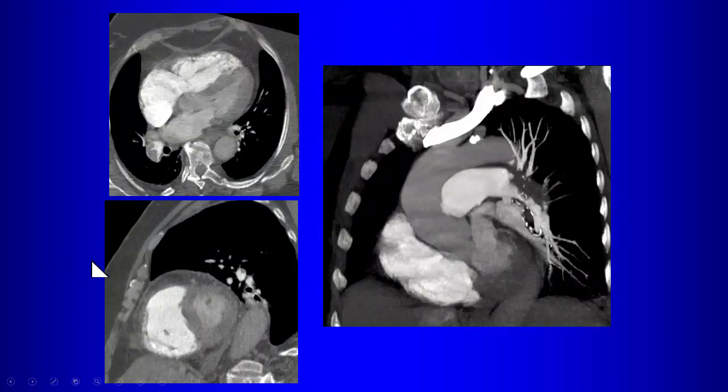Quick question. Since we're talking about PE, the article said that when we have Hounsfield units of 170 to 209 in the pulmonary arteries, that's acceptable. But if it's greater than 210, that's fine, you know, but what do you say in those cases? Well, okay, I mean, the most dangerous thing is a radiologist with a ruler or a measuring device, I think. You use your judgment, all right?